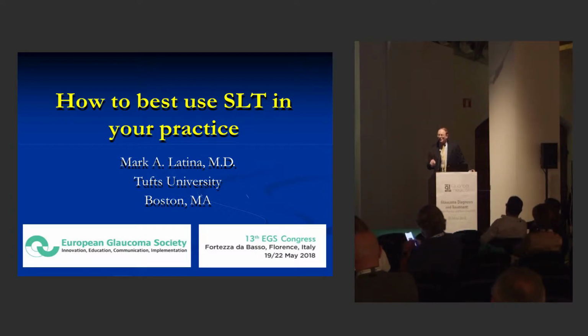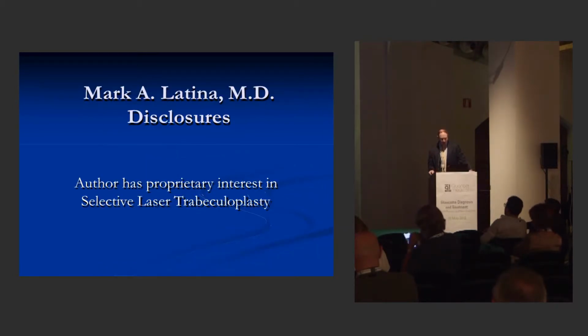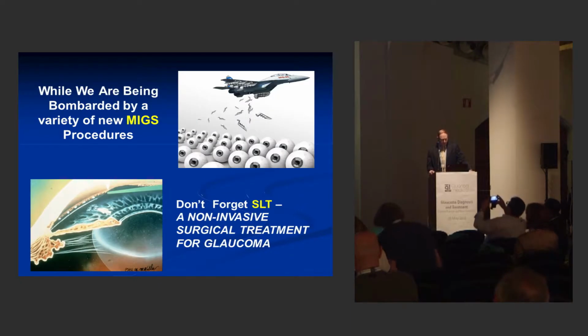And he's still using it, which is good. So I'm going to talk a little bit about how to best use SLT in your practice. We're being bombarded by MIGS procedures, and all these new MIGS procedures, everybody's great now, and we have something for everybody. But again, I don't want you to forget that SLT is a non-invasive surgical treatment for glaucoma, and we should probably still be using this before the MIGS procedures.